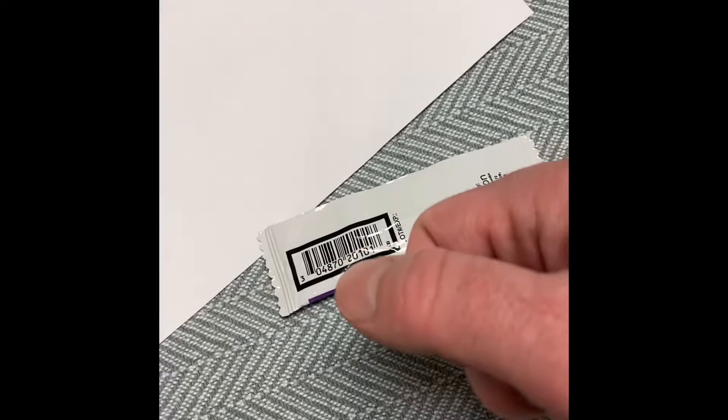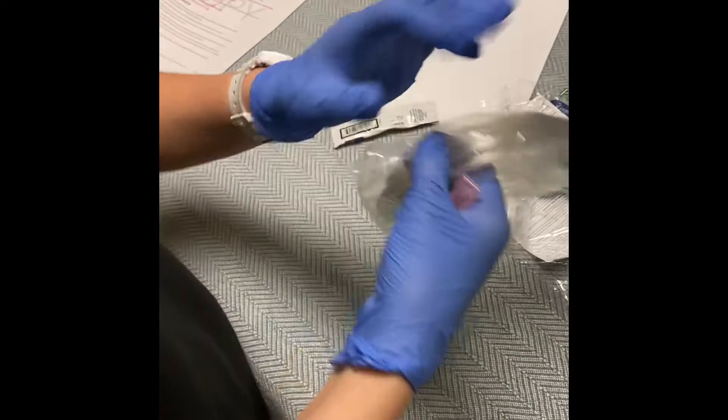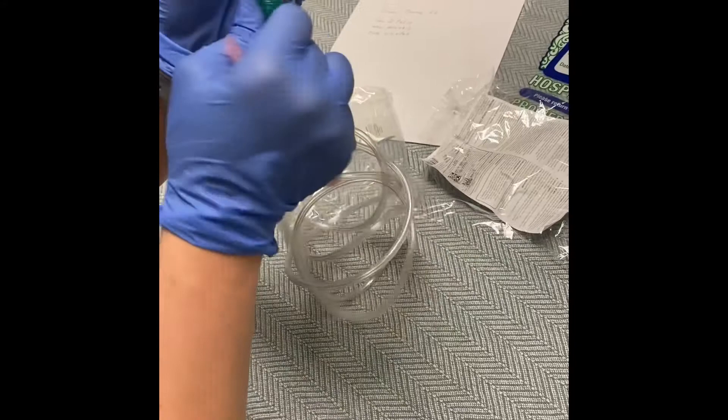Your nebulizer comes with minimal assembly required. Just remove it from the package, open the connective tubing, connect the tubing to the nebulizer, and connect this end to the flow meter, like so.